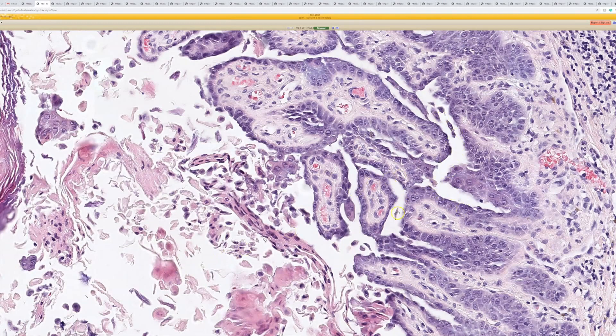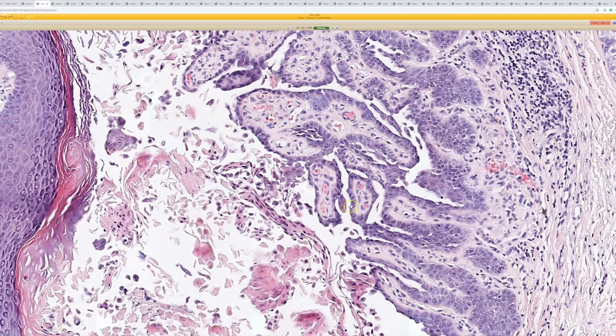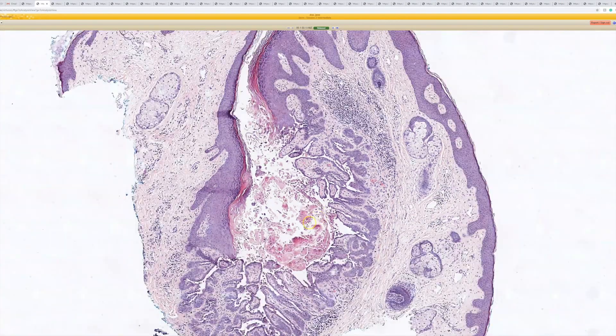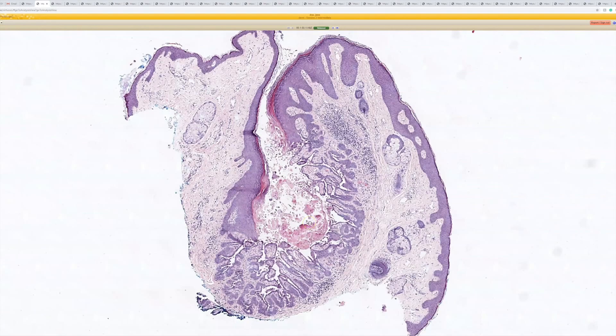here you can see nice acantholysis giving you this kind of invaginated, almost frond-like appearance. And the key to it is that it's acantholytic and dyskeratotic, and it's in a kind of invaginated cystic lesion, usually on the face, right?